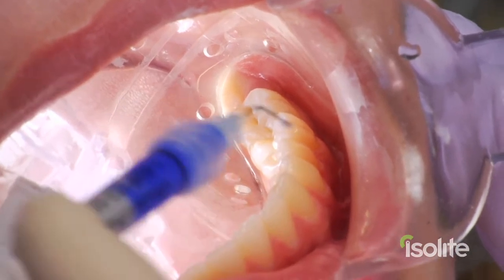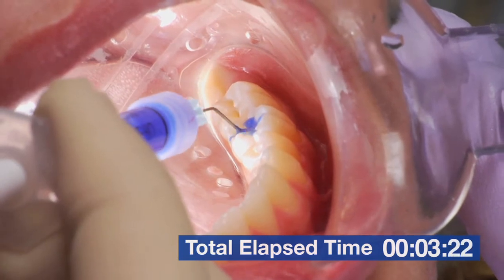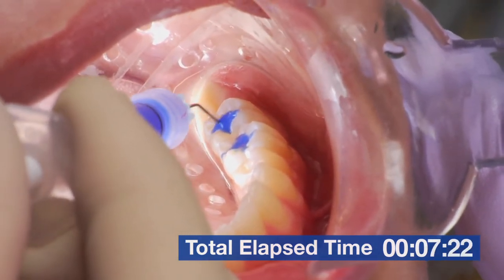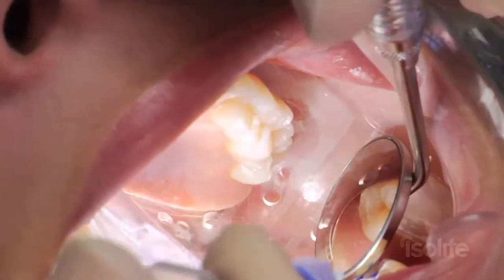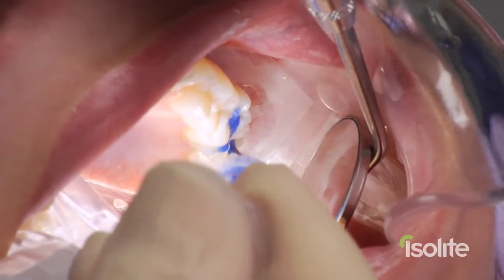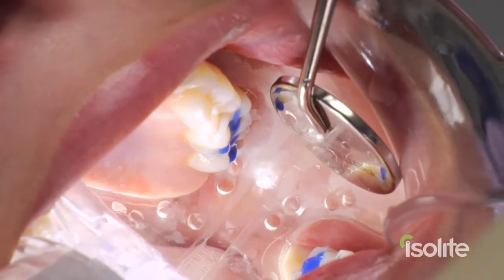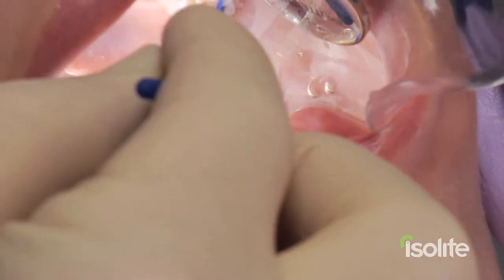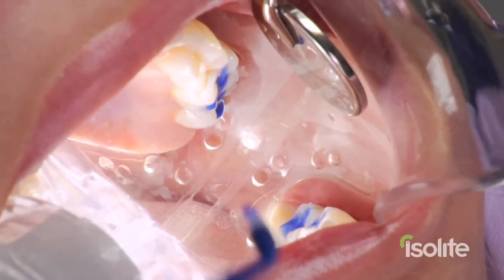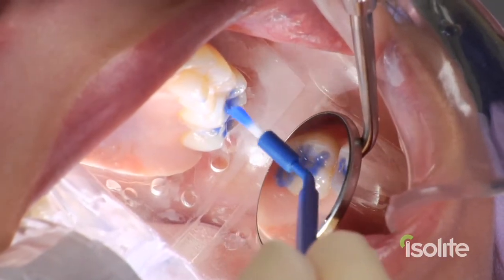Let's start our timer now. We're going to etch number 19, number 18, number 14, and number 15. Brush that into place. Start our timer for 30 seconds. And that is a good view where all the teeth are going to etch at the same time.